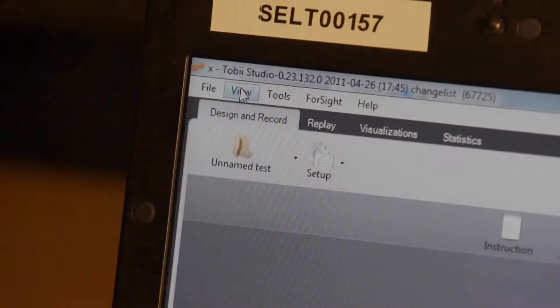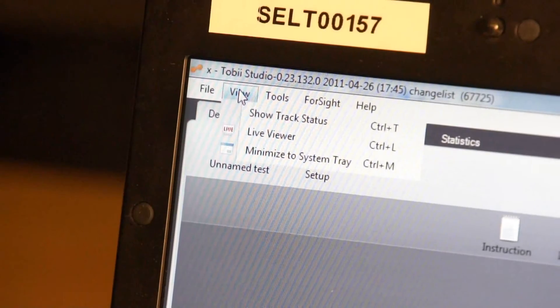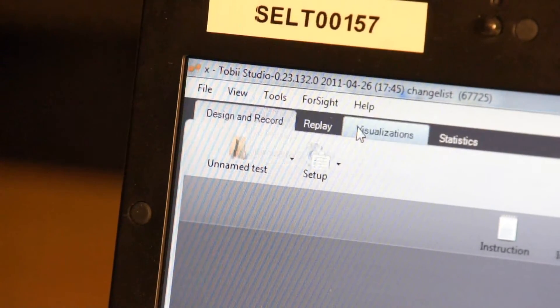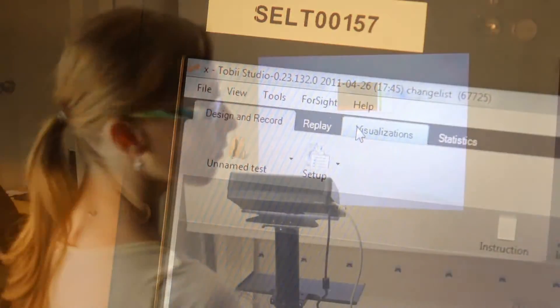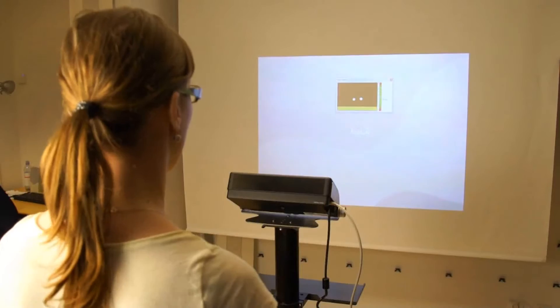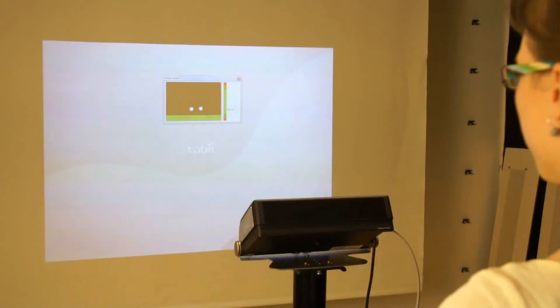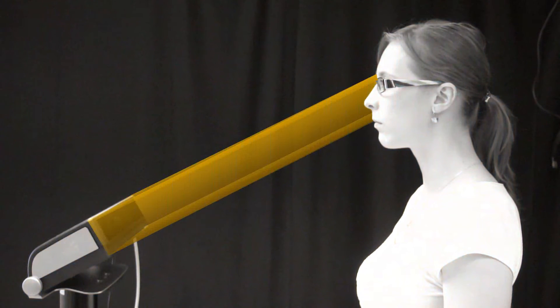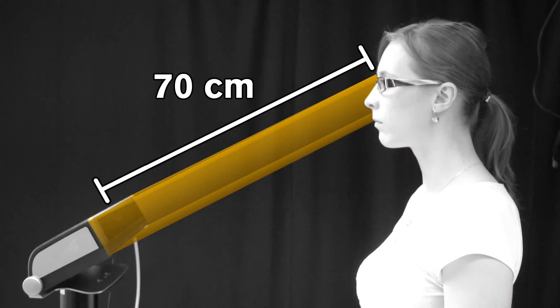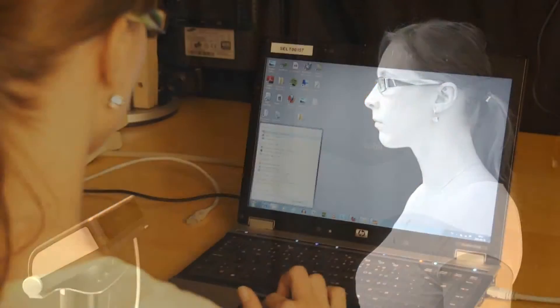In Tobii Studio, go to View then Show Track Status. Place a person in front of the eye tracker and adjust the eye tracker so that both eyes can be seen in the Track Status window. Make sure that the distance between the person's eyes and the eye tracker is approximately 70 centimeters.